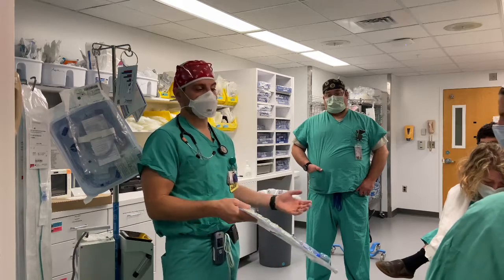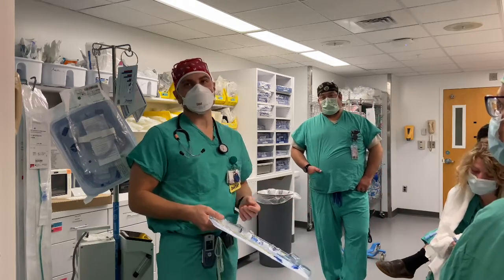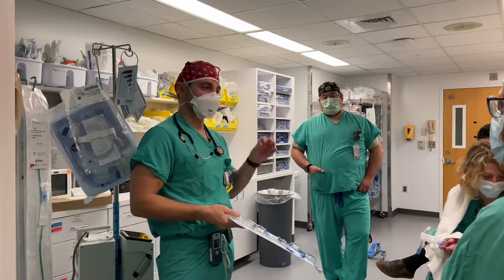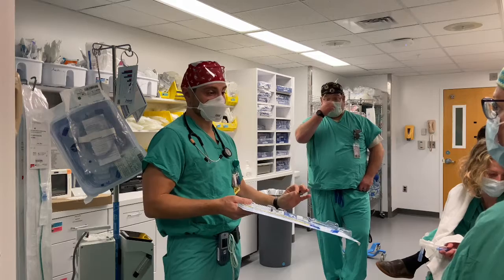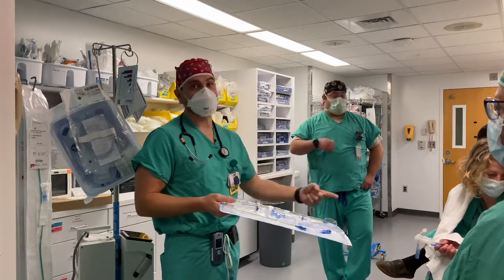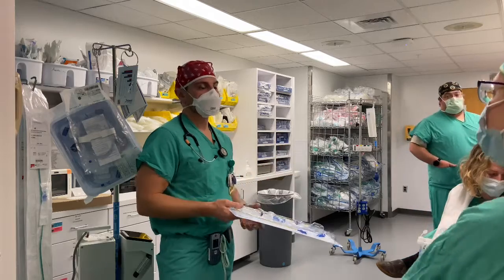Okay. So a congenital diaphragmatic hernia on a newborn, there's no newborn size double lumen tube. And so what you do is put a single lumen tube in, and you can either put the bronchial blocker through the tube, or in pediatric cases on the side of the tube, actually go around the outside of the balloon and then inflate the balloon and use it that way.